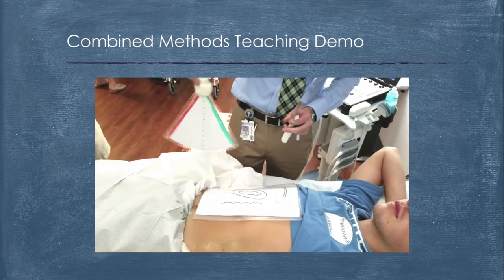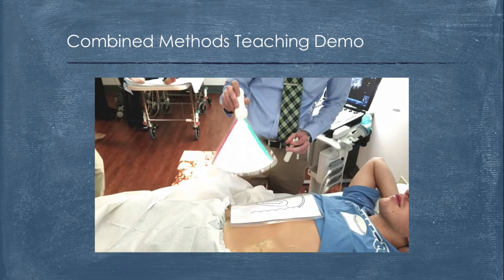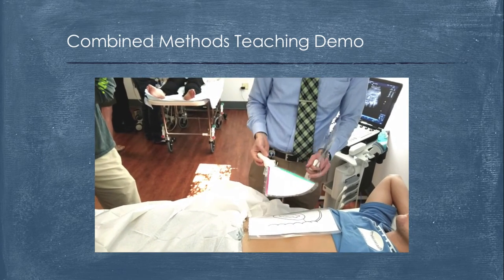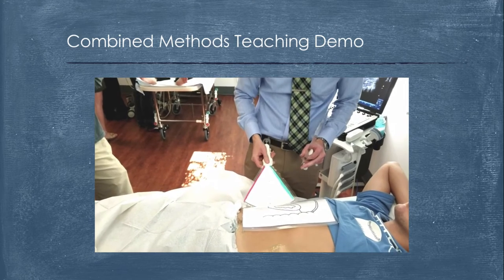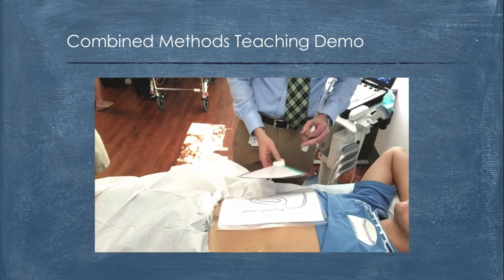So this is rocking the probe, back and forth like this. This is fanning the probe, like this. This is twisting the probe, rotating it like this. And then sort of moving it along the body is going to be sliding the probe, right?